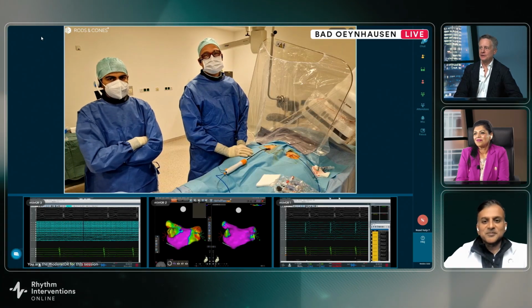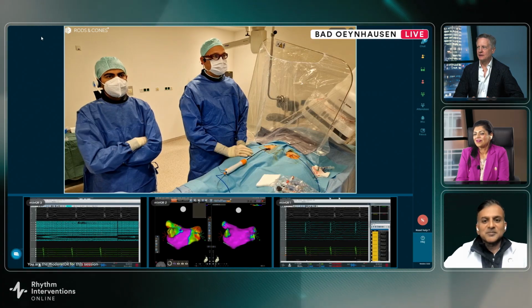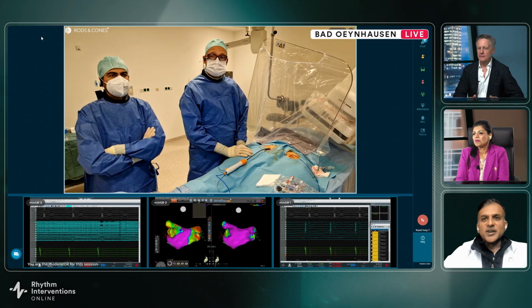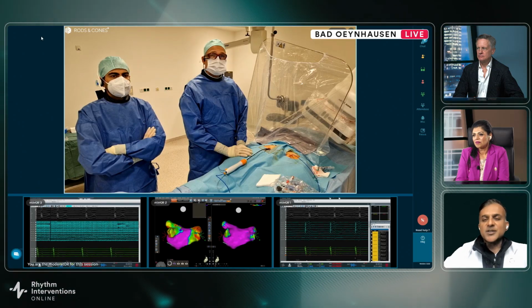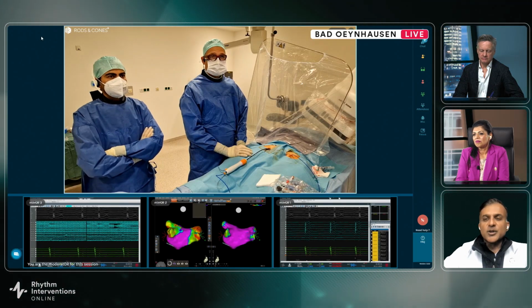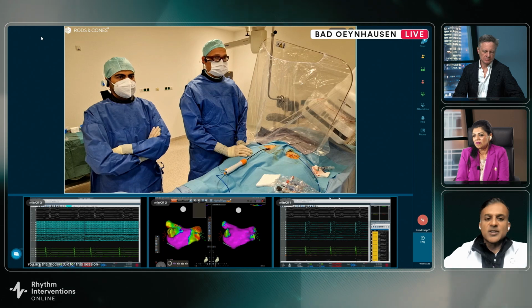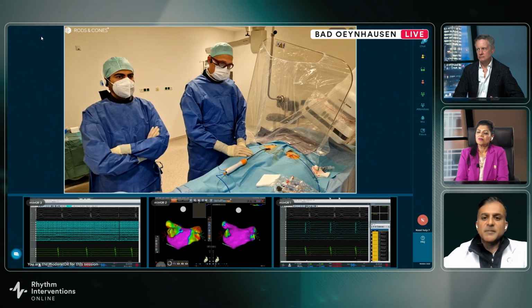I think there's an insurer issue in Germany that's now being resolved, isn't it? Which is why you haven't really done it. Kousik, do you do same-day discharge? Yeah, I would say more than 90% are same-day discharge. We generally do 3 accesses, but on the same side, since we use intracardiac echo, a lot of vascular closure, either Vascade or Perclose, and 2 hours ambulation or less, and more than 90% go home the same day.